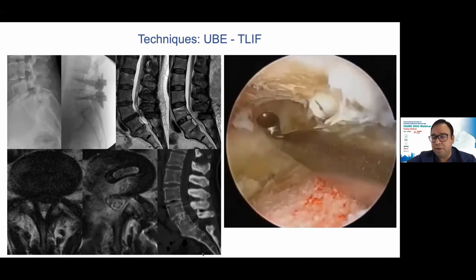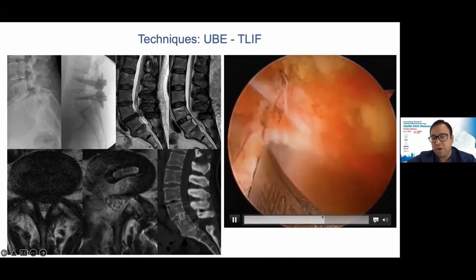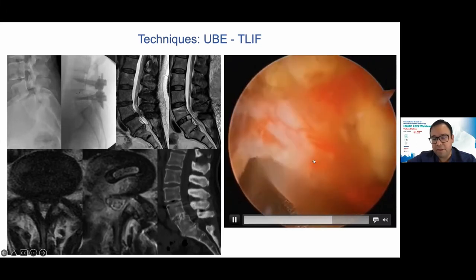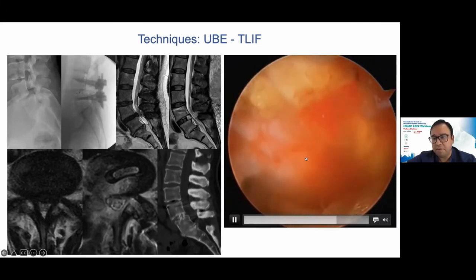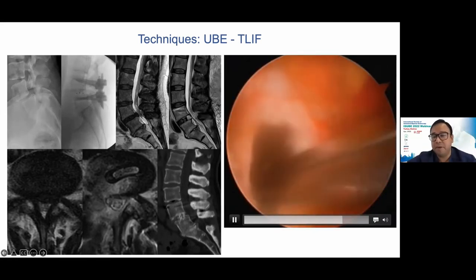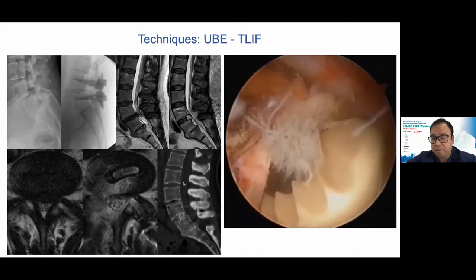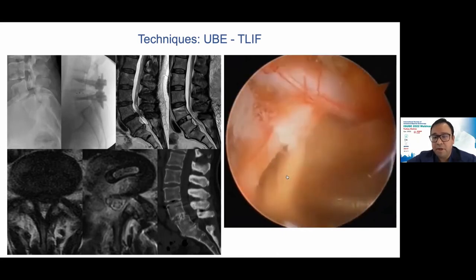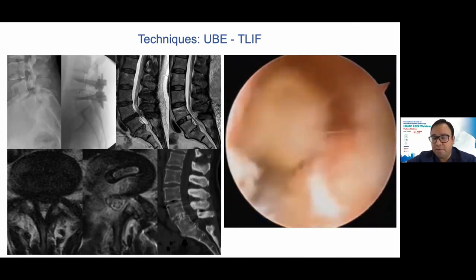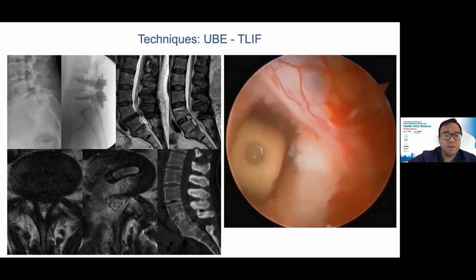In this video, we show how we perform a biportal endoscopic fusion. We decompress the foramen. We identify the neural elements. We prepare and identify the end plates, and prepare them very well under endoscopic view. And finally, we perform the fusion, delivering the graft, the bone, and the cage.